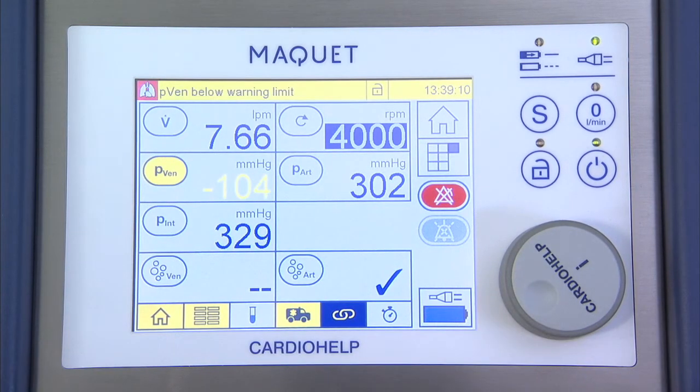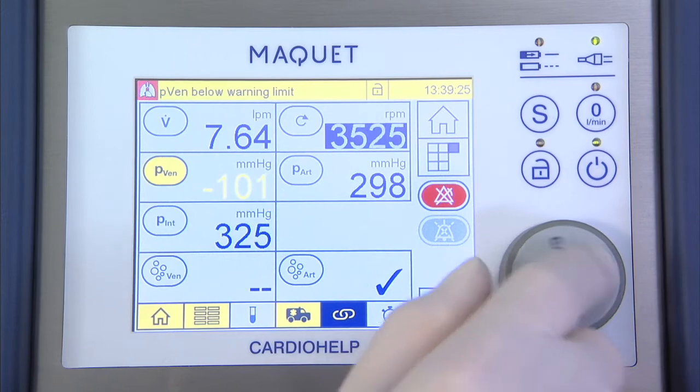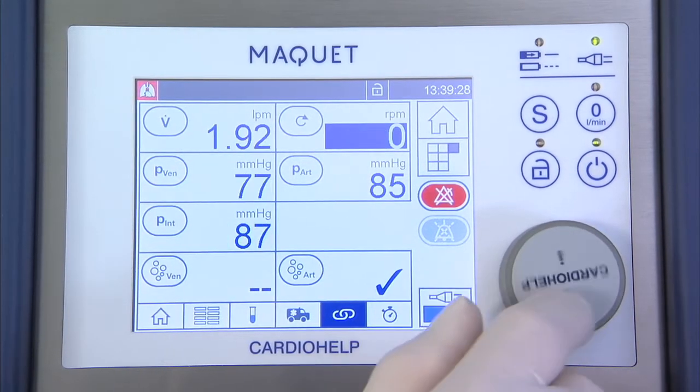Increase the speed to 4000 revolutions per minute for one minute. Then set the drive to zero revolutions per minute.